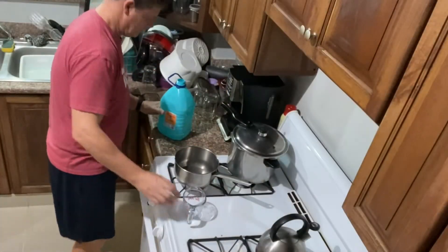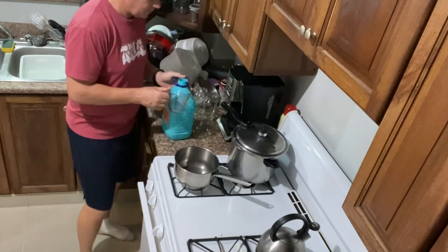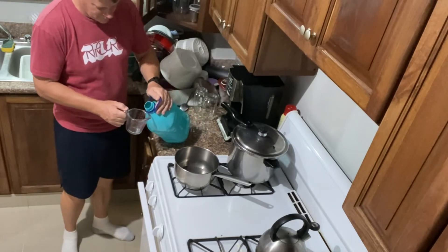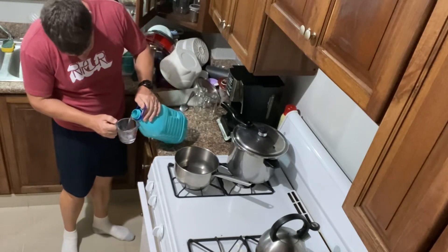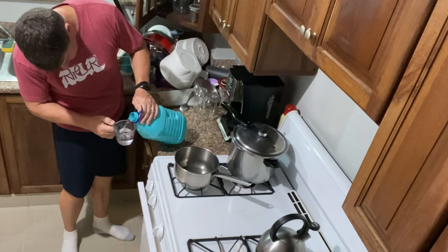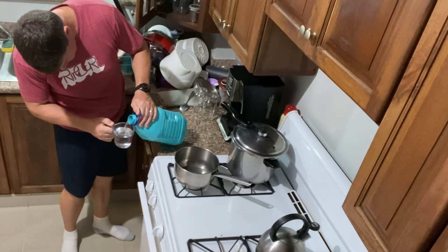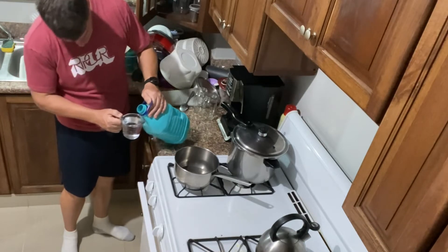The powder that I got makes one liter of solution, so the instructions say to take 80% of the water you're going to use. I was going to do this in two batches, so I took 400 milliliters of water, measured it out, added it to the pot, and brought it to a boil.